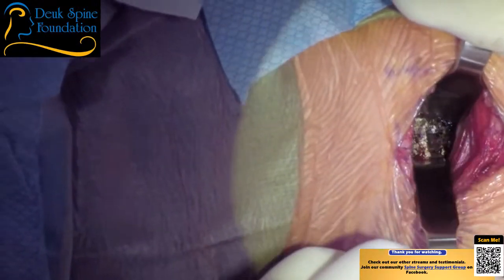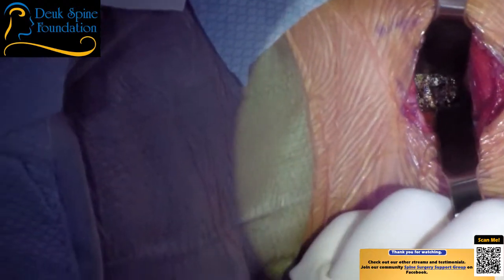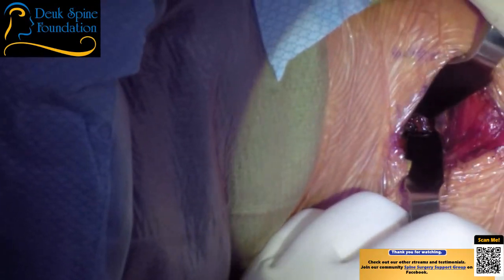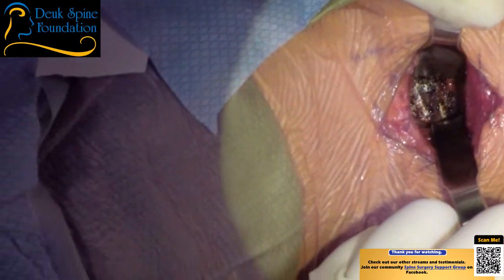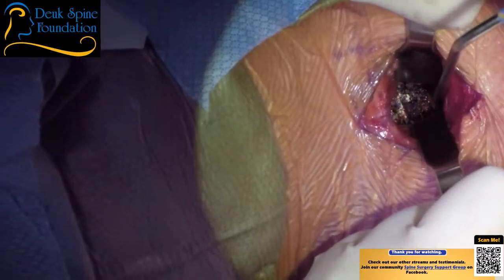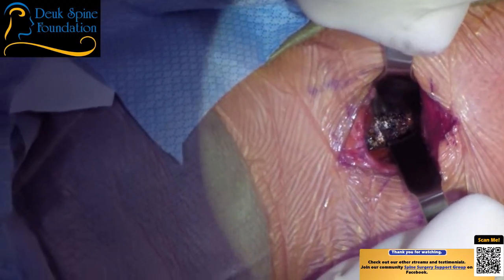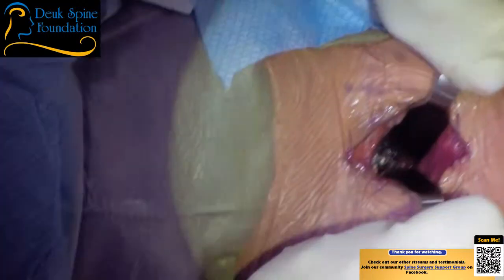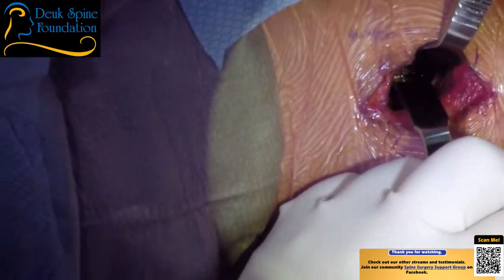So here we are. We've exposed half of C6 and half of C7 down below. Let me see down below. This is a deep, deep hole, Luis. So I'm thinking, what size retractors do we have? 55-60 right now, sir. That's the biggest? I think we have one. I think 55-60 might work. Let's try that. Let me see this, please. I want to see how much retraction you're doing.